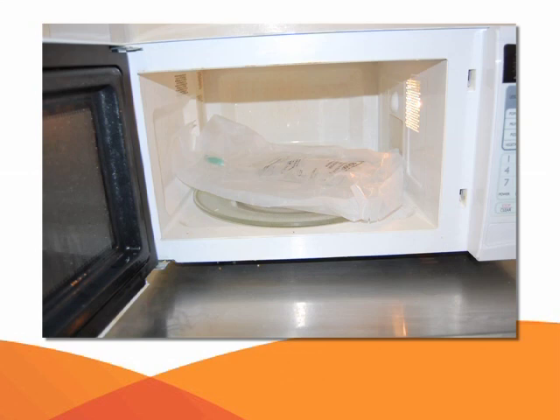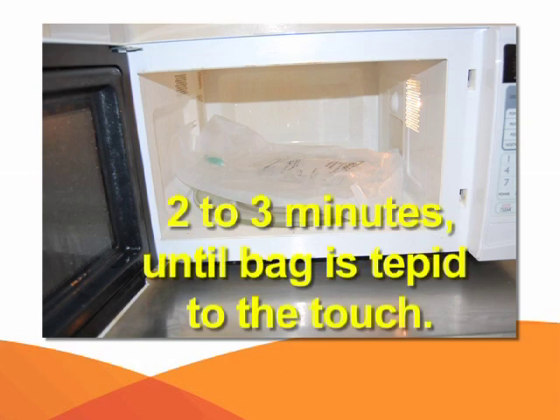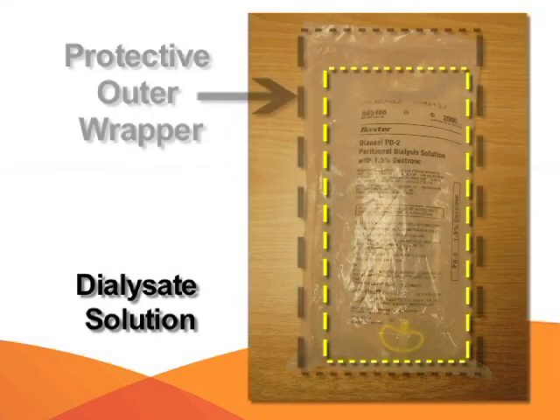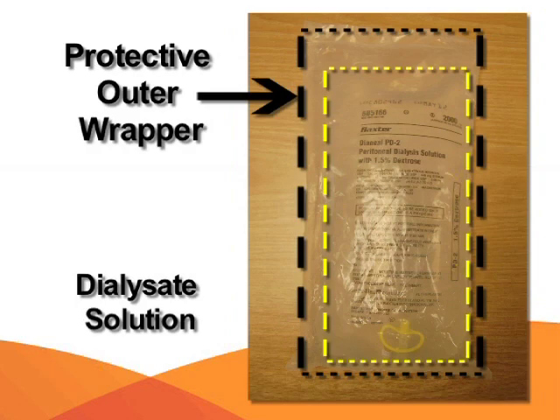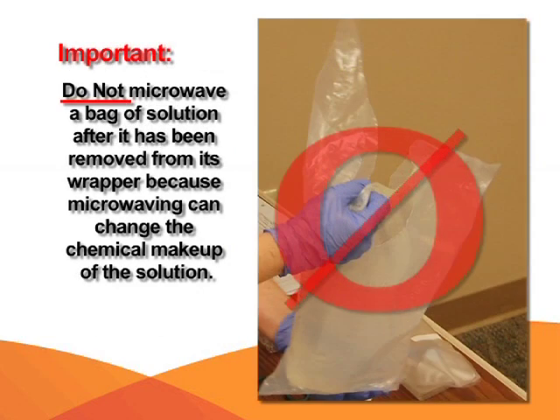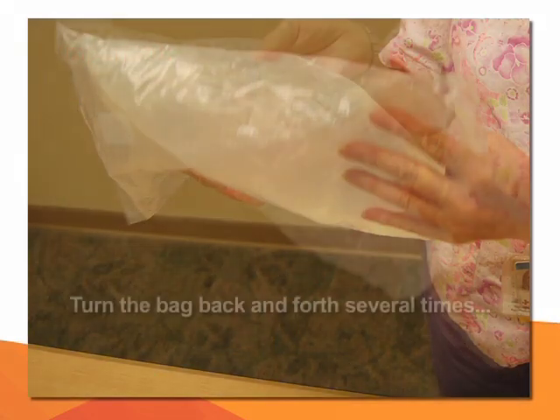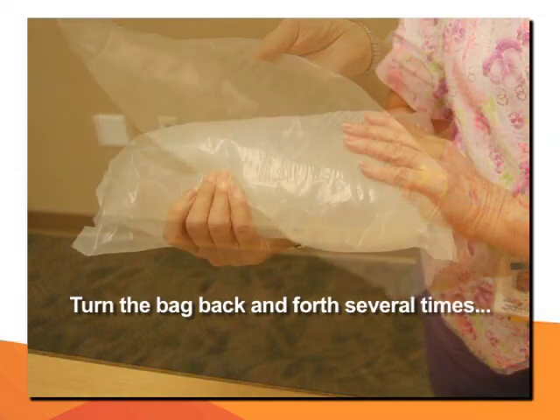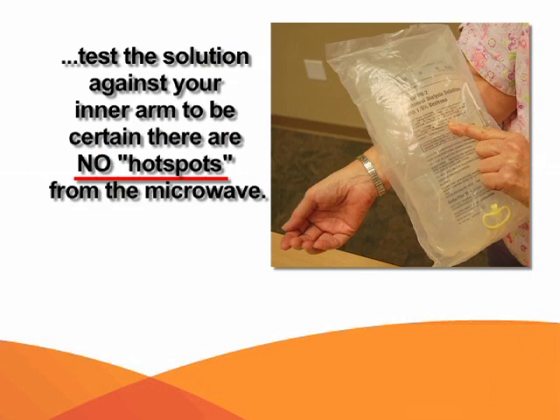Warm the CAPD solution in the microwave for two to three minutes until the bag is tepid to touch. Warming the solution is a comfort measure for the patient. Most solution bags come in a protective outer wrapper that allows for microwave heating. Do not microwave a bag after it has been removed from its wrapper, as microwaving can change the chemical makeup of the solution. Turn the bag back and forth several times and test the solution against your inner arm to check for hot spots.